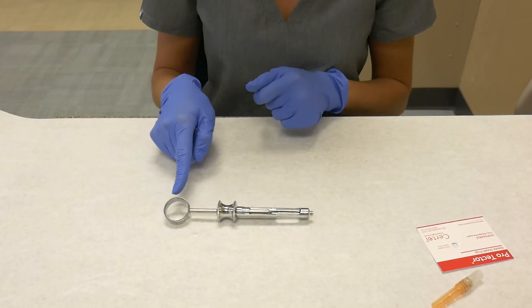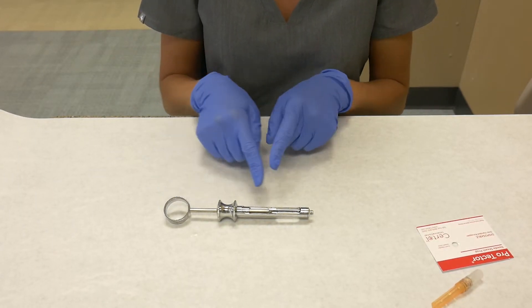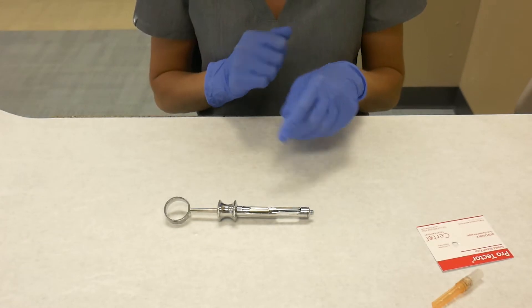Here we have the syringe: the thumb ring, the barrel of the syringe, which contains the piston with the harpoon, and at the end the threaded needle adapter.